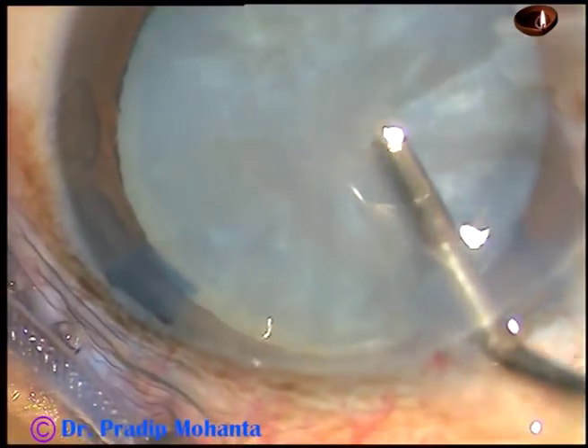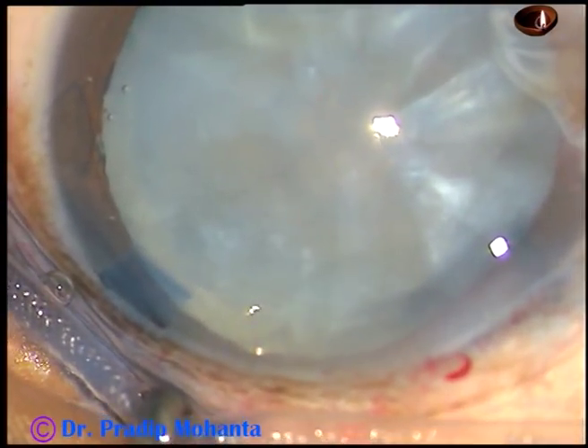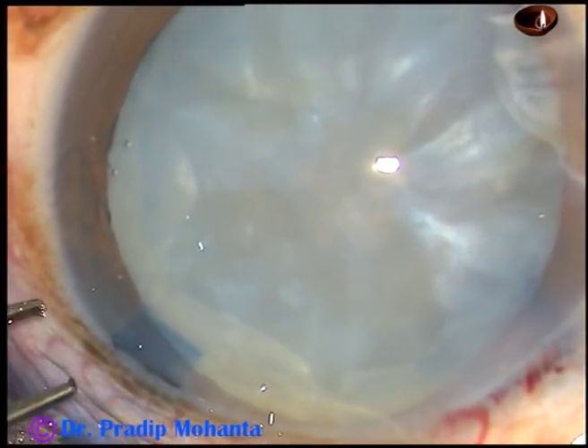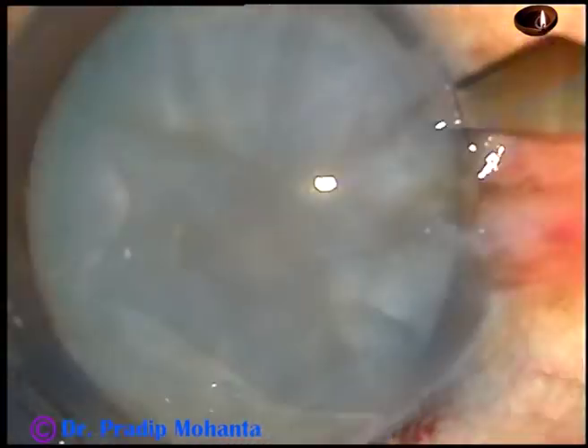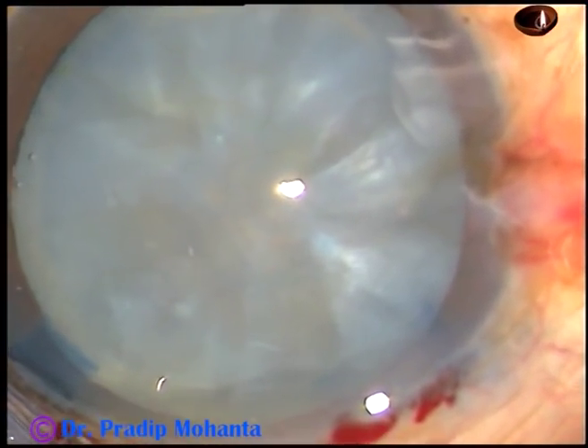Now, this is hydroxypropyl methylcellulose — it is not sodium hyaluronate. I am not against it, but it is possible to do a nice capsulorhexis using only 2% HPMC.